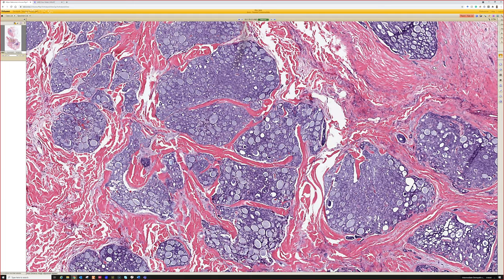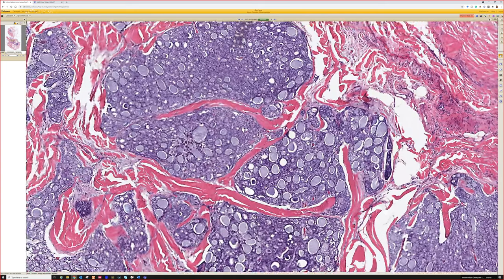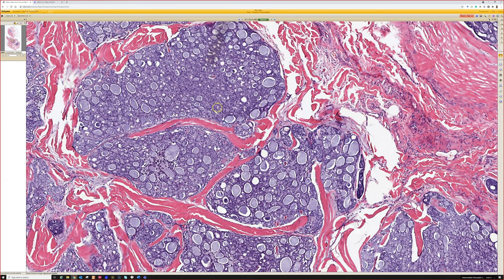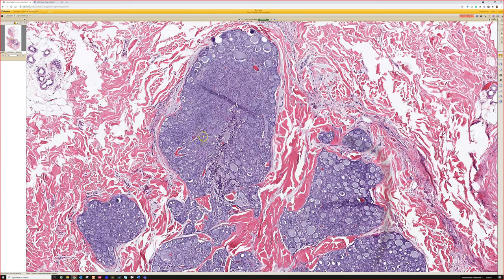So one thing this could get confused with is basal cell carcinoma, which we know can have adenoid change or blue mucin-filled spaces. But in adenoid basal, the blue spaces are very irregular in size and kind of loosely organized, and you'll have other areas that look like classic basal. In adenoid cystic, to me, this is a very characteristic look that the spaces are very sharply punched out, very sharply circumscribed. I mean, they do vary in size a little bit, but you can see how very perfectly round they are.